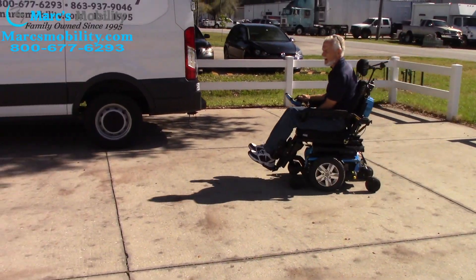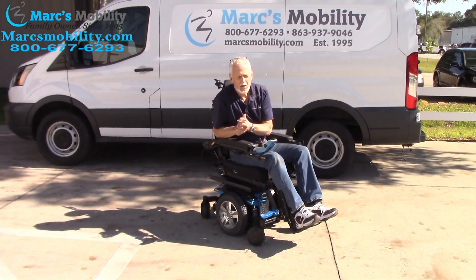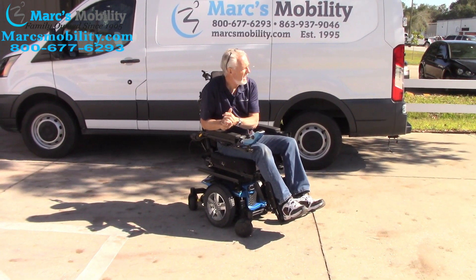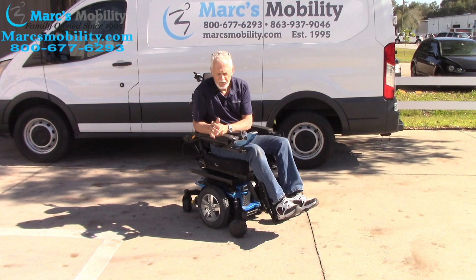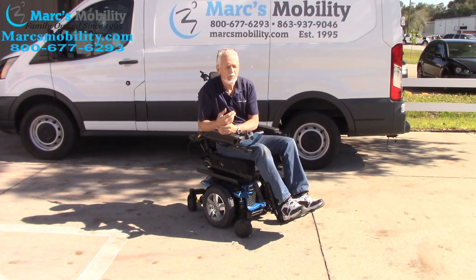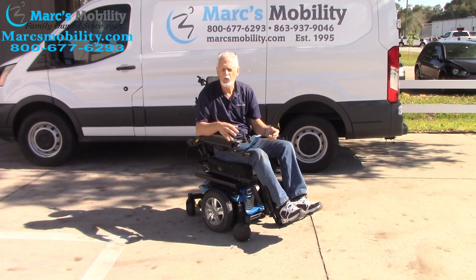No problem on the grass. If you're going to use it in the grass and your ground surface is hard, you're fine. If your bottom is soft and mushy, it's not going to be nearly as good. But with a hard surface like this, no problem at all. So this is a nice chair with two miles — Quantum Edge 2.0 with electric tilt, electric recline, and electric legs, almost brand new.